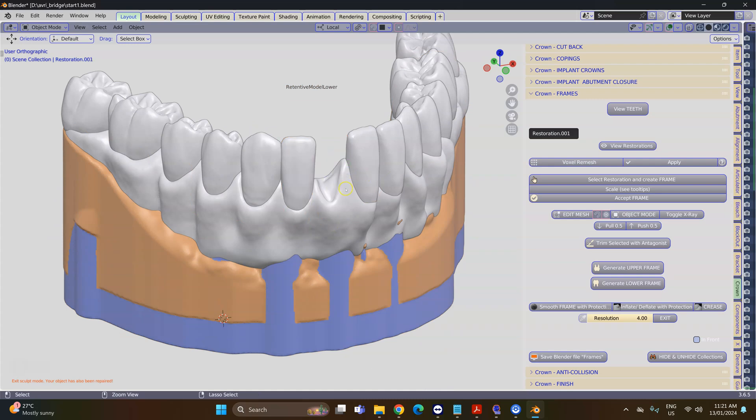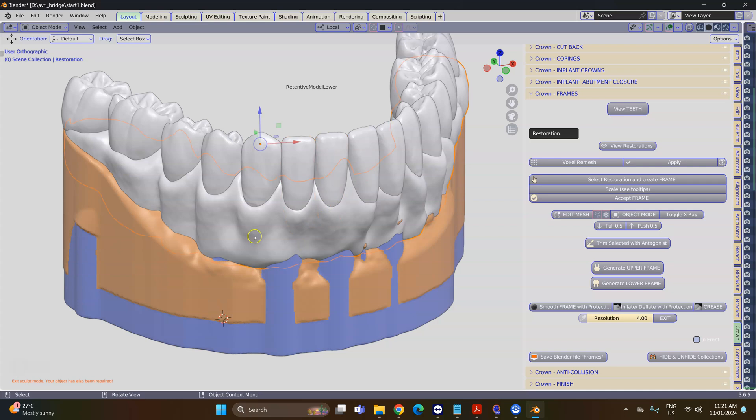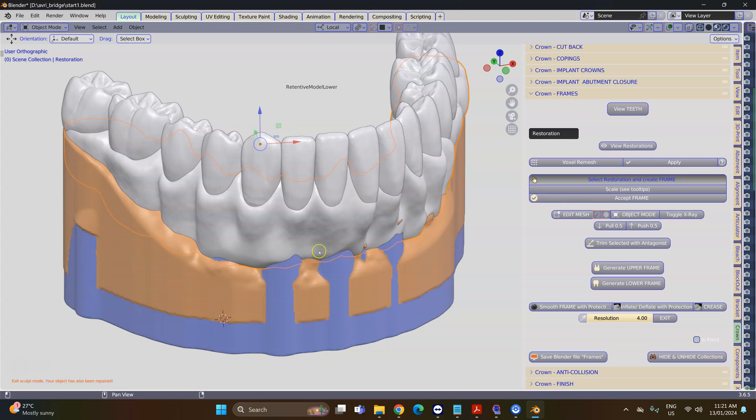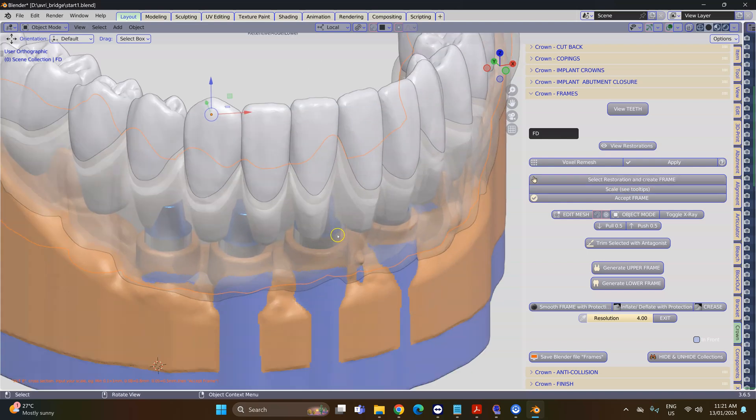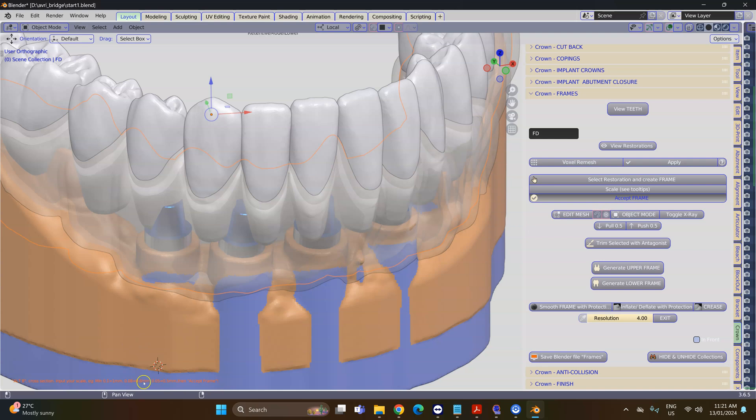Select the tissue object and then select the restoration and create a frame. This will reduce this frame and make it smaller. If you need information on the lower tooltip, it'll tell you by how much. Then we're going to accept this.